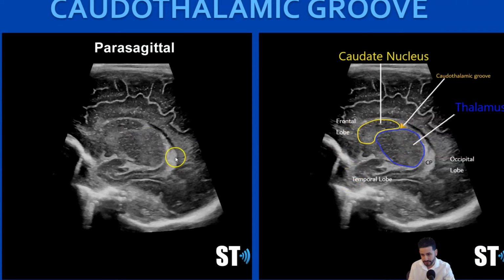And it's important to note that the echogenicity of the choroid plexus is going to be very similar to grade 1 bleeds. But the location is important. The choroid plexus usually begins about 1/3 to halfway of the thalamus. And then it tapers there. So if you have this there, a lot of people when they first start scanning, they confuse that with blood. That's not blood. That's the choroid plexus. So the location here, if you have a little hump there, that's echogenic. Then nothing, then the choroid plexus, that part is the blood.